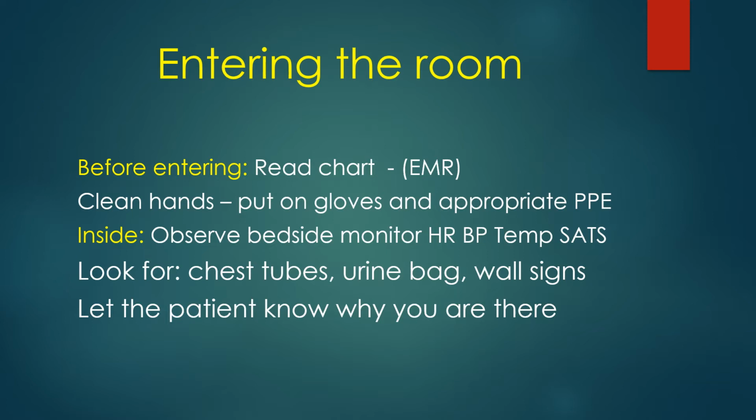You may have a patient who is awake and looks at you, and he's on a ventilator. He's in the intensive care unit. He's probably worried, and everybody comes in the room. He really wants to know what that's about. So you explain to him that you're the respiratory therapist and you're just doing your routine checks with your machine, just making sure it's doing what it's supposed to be doing, and not to be concerned about it.